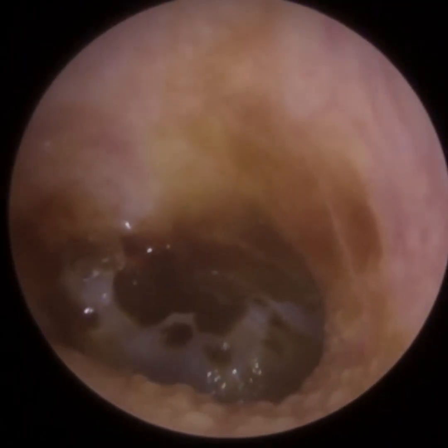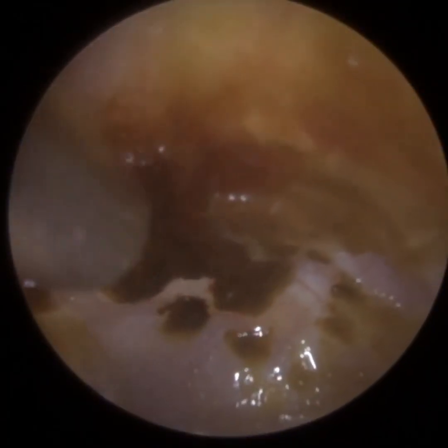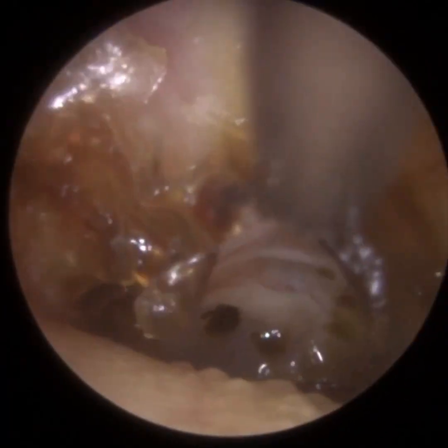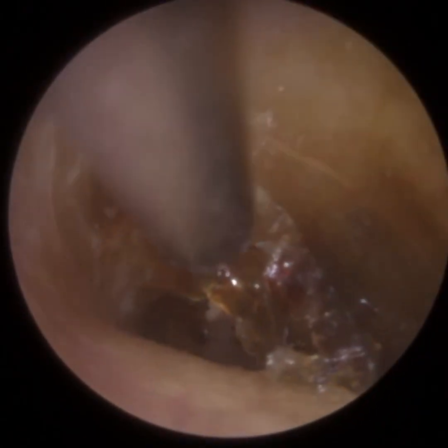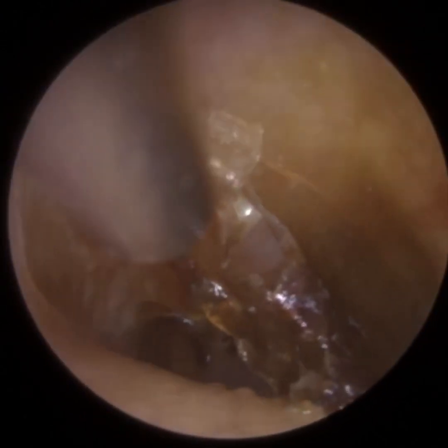So I'm just using a fine end suction probe, and I've removed a bit of dead skin right near the entrance. So I'm just going straight to the eardrum now, and we're going to be really gentle. You can see I've just peeled this layer of dead skin off the drum, and the skin extends to the roof of the ear canal. It's almost like a snake skin, when a snake's shedding its skin.